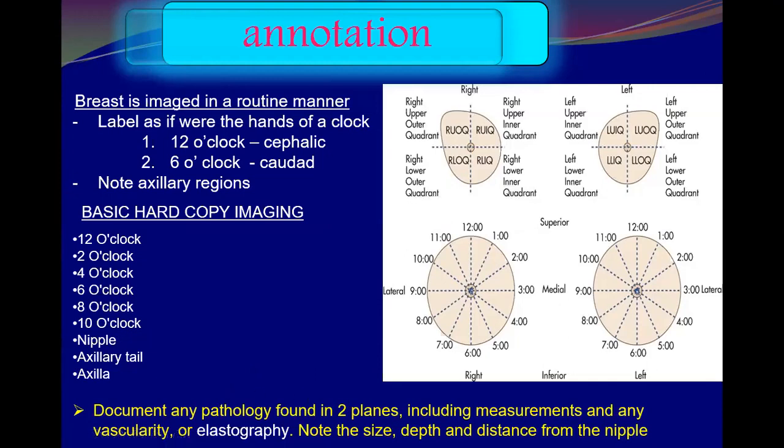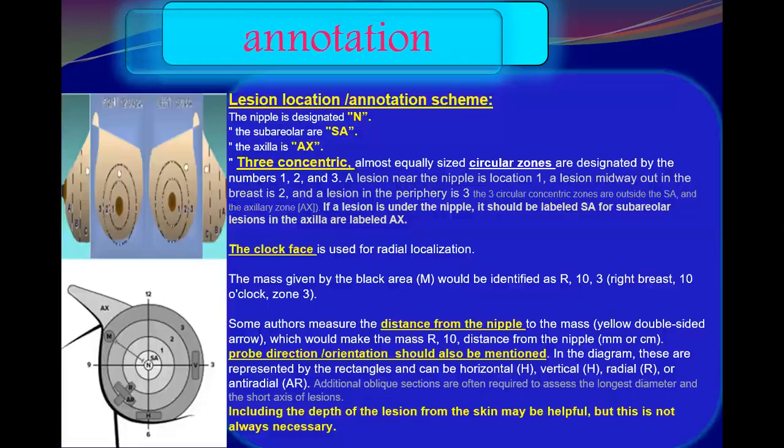We have to include measurements. We have to include any vascularity or elastography, documented, not just mentioned in the report. We have to capture the image. And we note the size, depth, and distance from the nipple. We'll go through that.